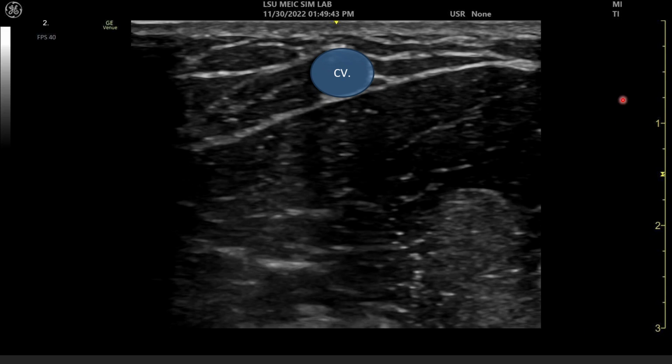So again, previous images, let's compare this cephalic vein here. We're located a little bit more medially on the patient's arm, so the biceps muscle rounds out here, with brachial veins over here, brachial artery, and basilic vein a little bit deep to that. So we just roll our probe, keep that probe marker oriented to the patient's right, and slide over more laterally. Then we get this anechoic round structure, colored blue here, cephalic vein, deep to that, muscle fascia, and biceps muscle.